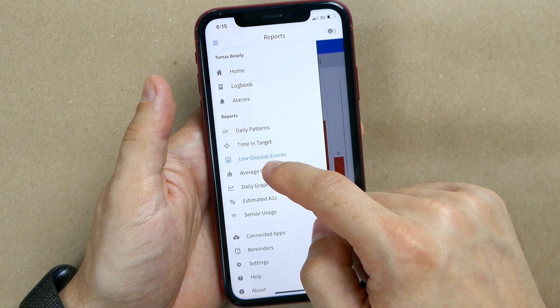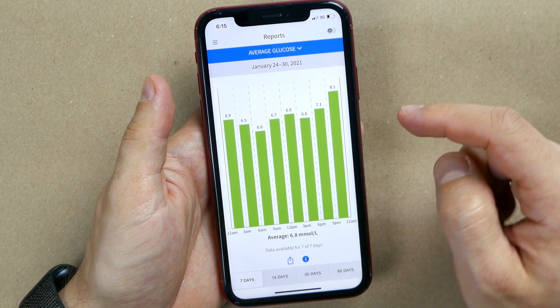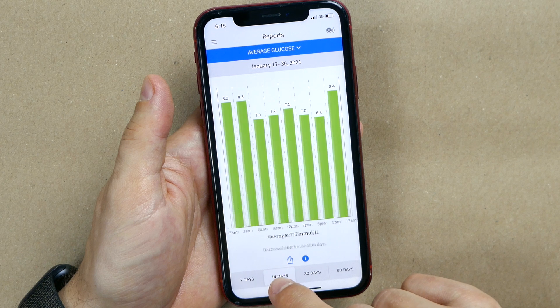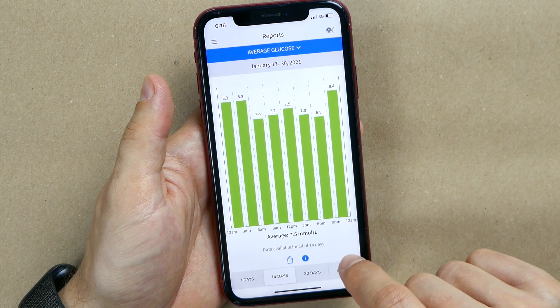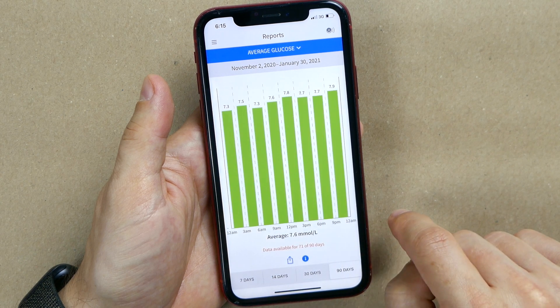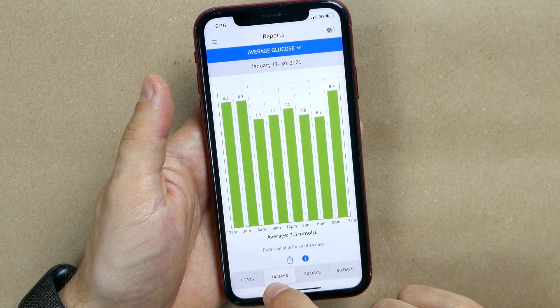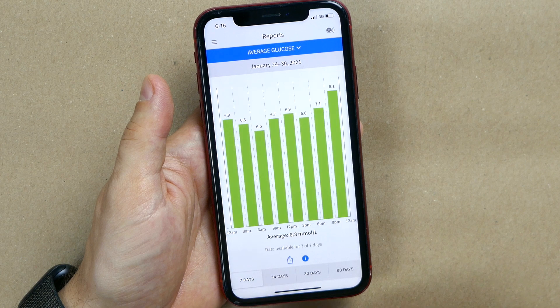Next is average glucose. I don't use this one much because I don't usually see big trends here — the daily patterns screen gives me much more information. But it can be helpful if you see some columns much higher than others, which might indicate that during certain times of day you are regularly going high and need to do something about it.